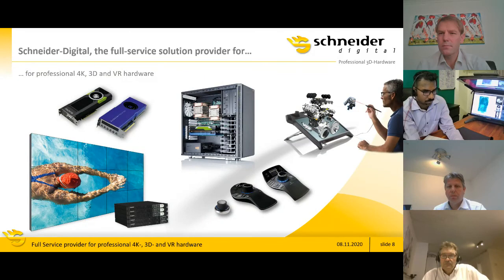Schneider is, of course, not only limited to the small displays, let's call them the desktop monitors, but we really deliver complete solutions. So we can provide a turnkey solution with a workstation that we build from very high quality components, very cost efficiently.